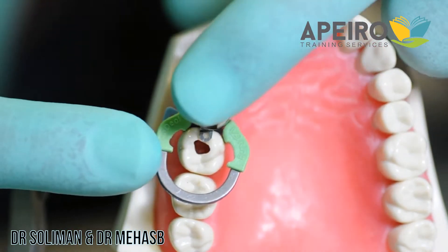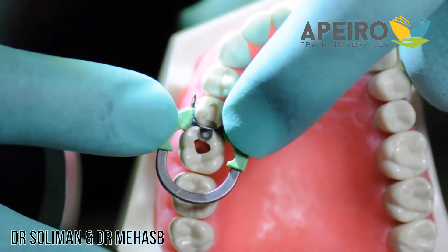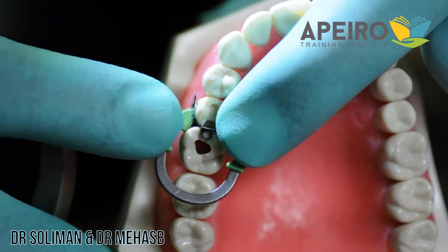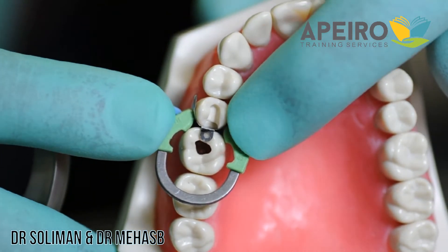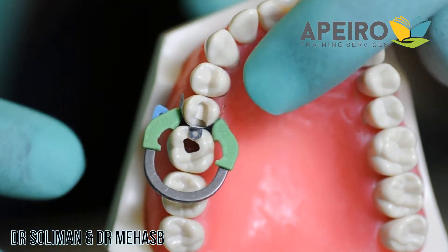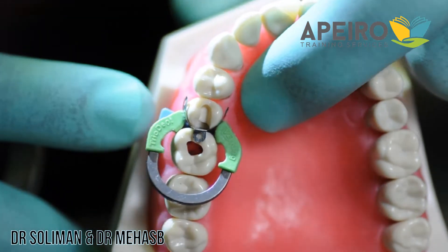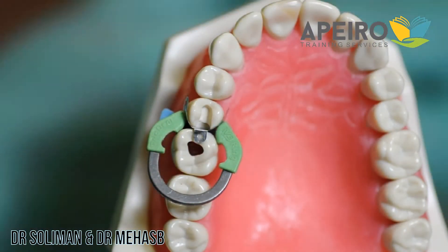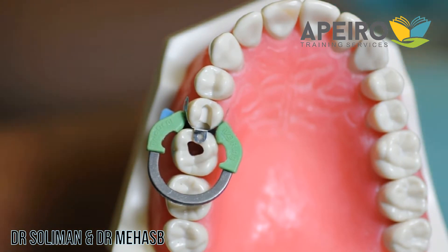The function of the ring is to hold the band and also cause some separation between the teeth, which gives a very good contact. After placing it, try to push it down toward the gums and make sure that the wedge is also secure.